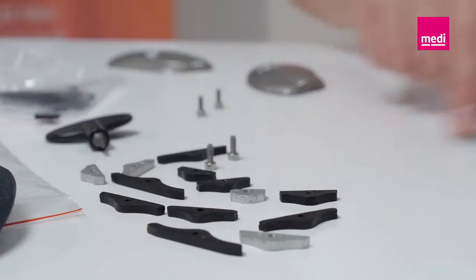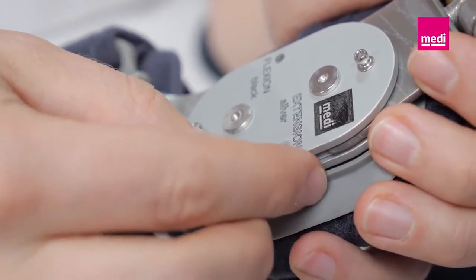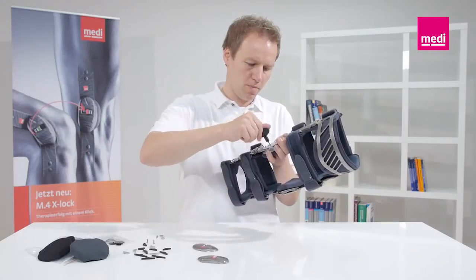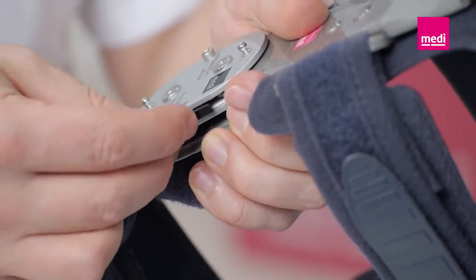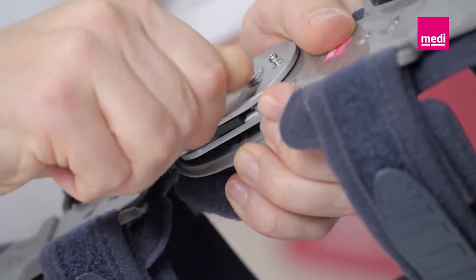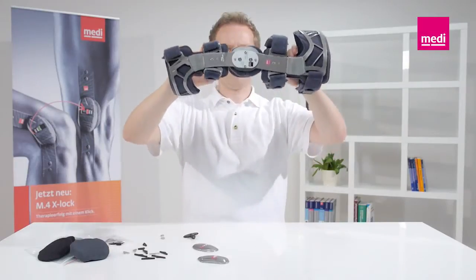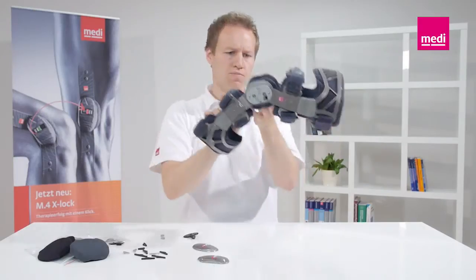Push the new silver extension wedge into the hinge from the front. Now place the screw in the thread opening and screw tight. The black flexion wedges are slid in from the back. Now move the orthosis hinges, check the positions of the wedges and secure the hinge cover.